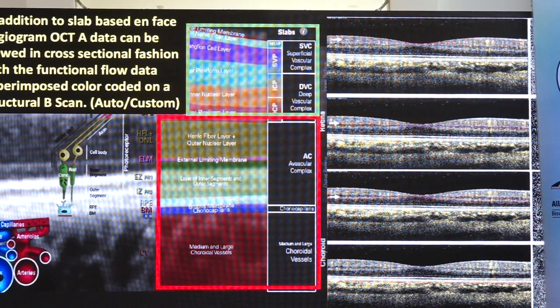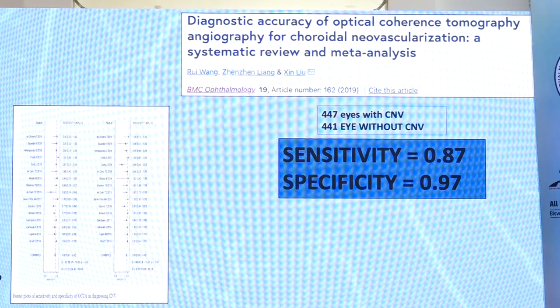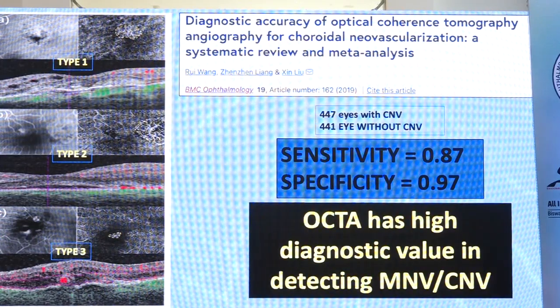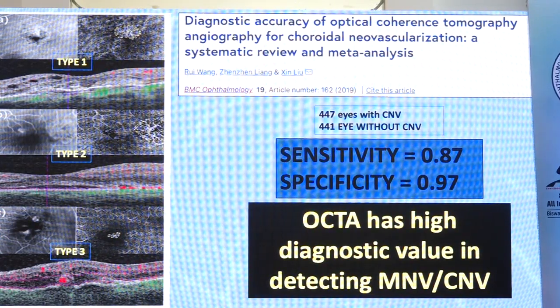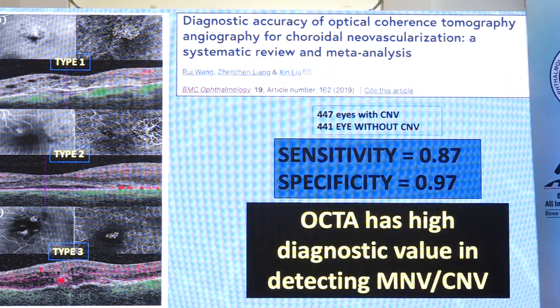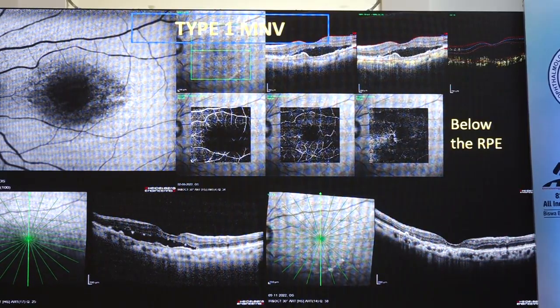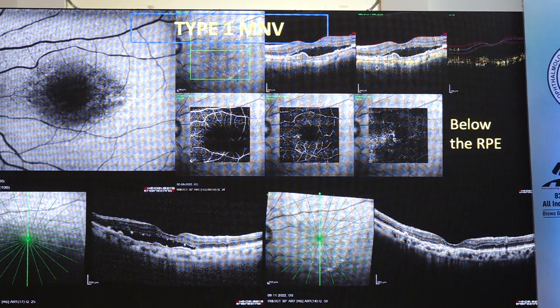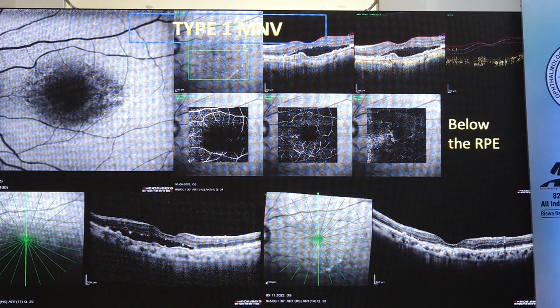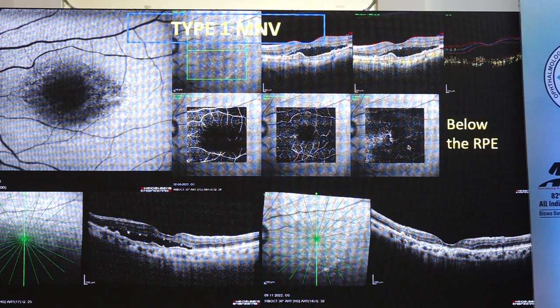OCT angiography has high sensitivity and specificity in detecting the choroidal neovascular membrane. Studies have demonstrated the ability of OCT angiography to clearly visualize all three types of macular neovascularization. This is a type 1 macular neovascularization where you can see the yellow flow below the RPE, and on the slabs you can see this network is present below the RPE.